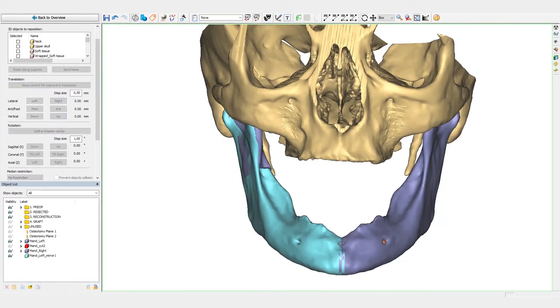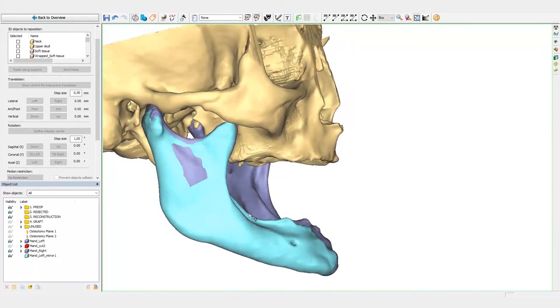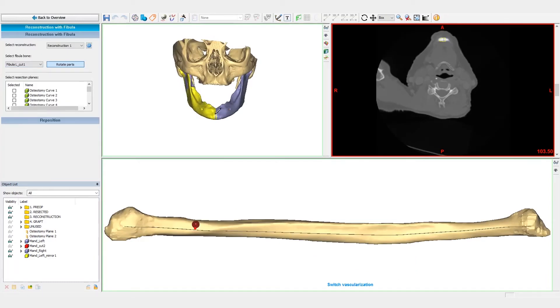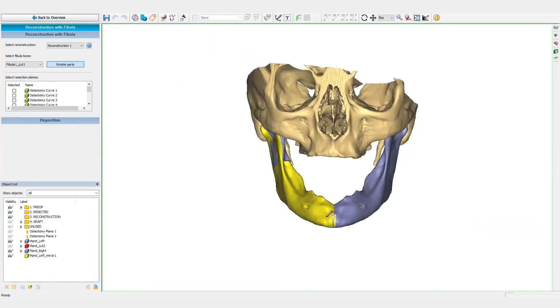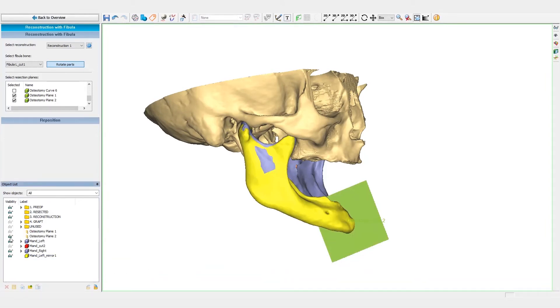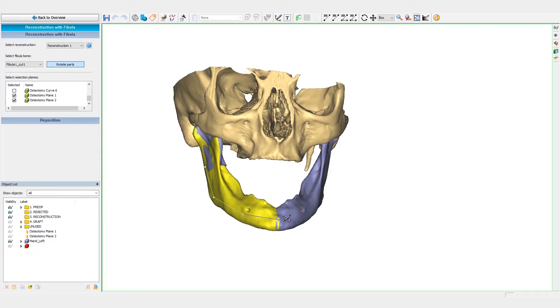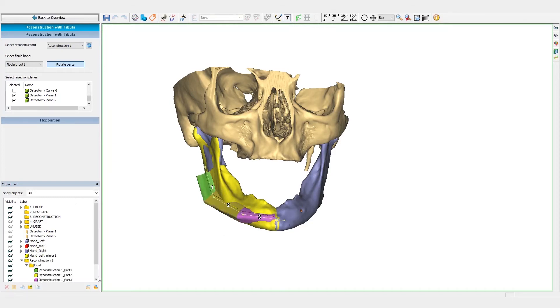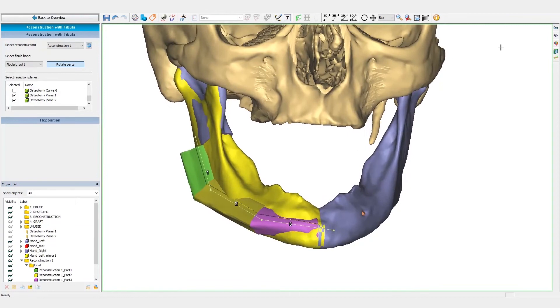The mirrored mandible will now be used as a reference to reconstruct the defect with the Fibula segments. Now, we will indicate the outline of the reconstruction. For this case, we will use three Fibula segments. An important benefit of this wizard is that the size and the positions of the Fibula segments is updated in real-time on the mandible and the fibula.